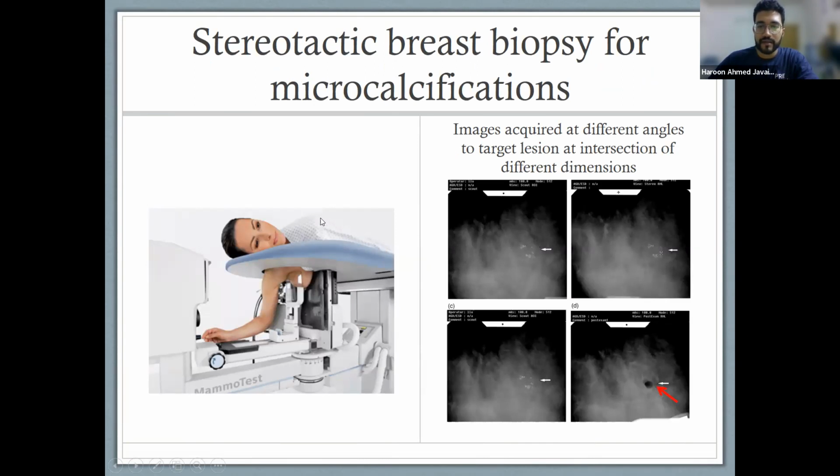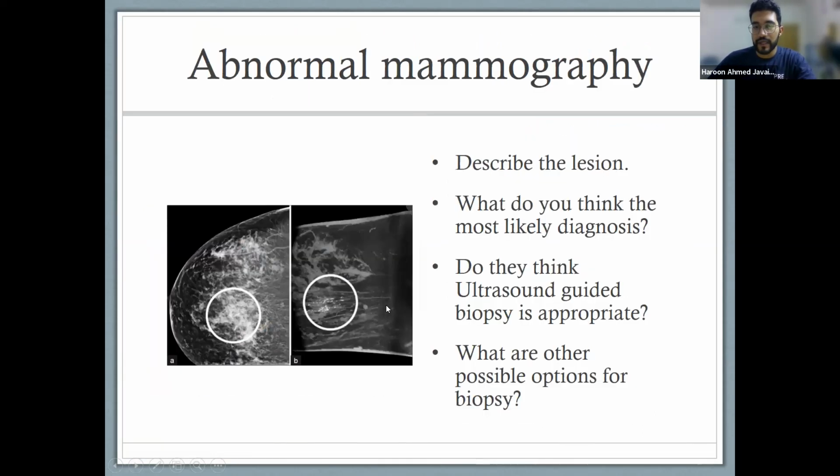Mammogram or mammography-guided biopsy. The example where this could be used is when there are some microcalcifications, but there is no breast lump.